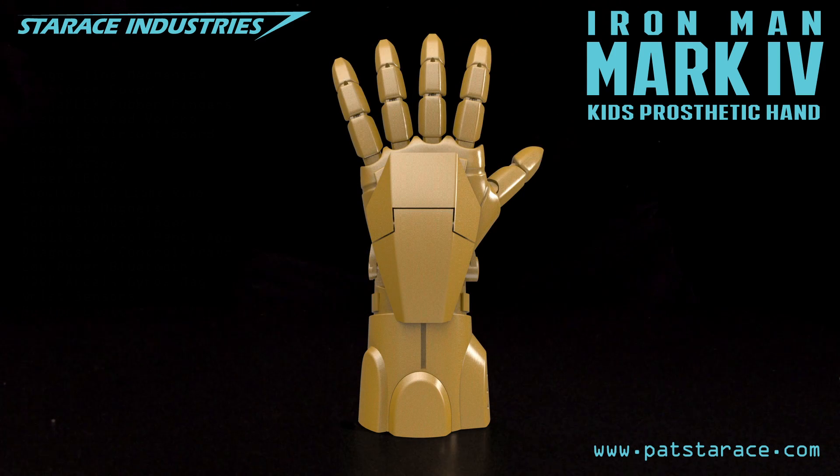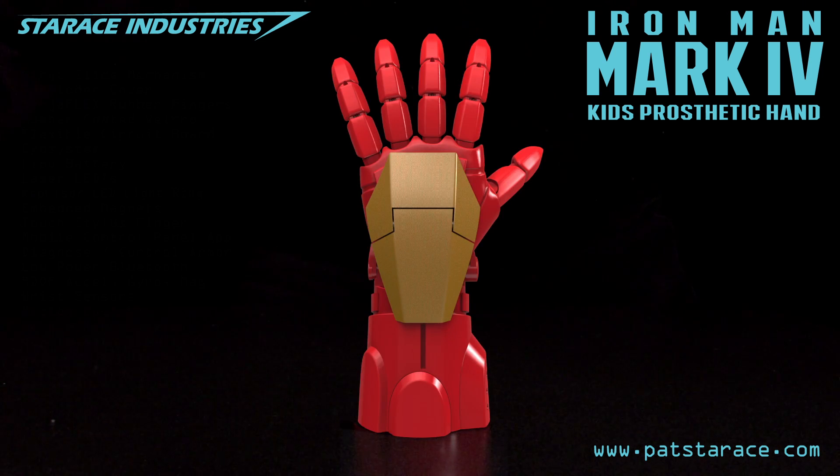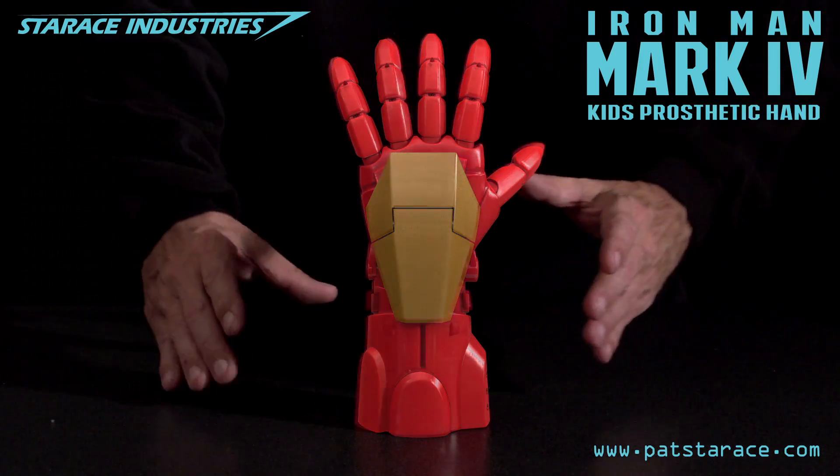Thrill me. The render is complete. Tell you what, throw a little hot rod red in there. Yeah, that should help keep a low profile. The render is complete. Yeah, I like it. Fabricate it. Paint it. Okay sir.